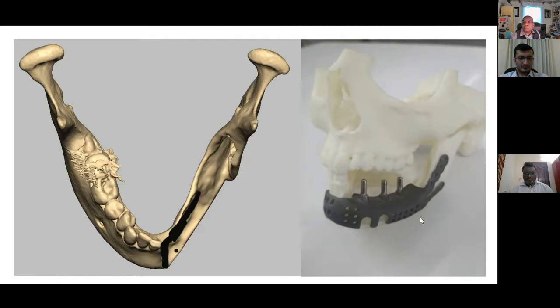This time, it is a benign pathology, and we maintain this lingual osteoperiosteal flap. After enucleating the complete pathology, we have literally scraped down the lingual cortex to paper thin, maintaining only a thin lamina papyracea kind of osteoperiosteal flap. And then we try to negotiate mobilizing the neurovascular bundle. That's the reason you can see those grooves. One of those grooves I could use for repositioning the mental neurovascular bundle there.